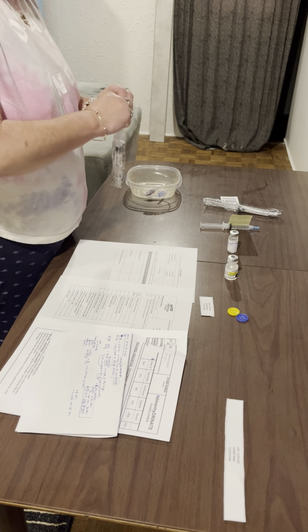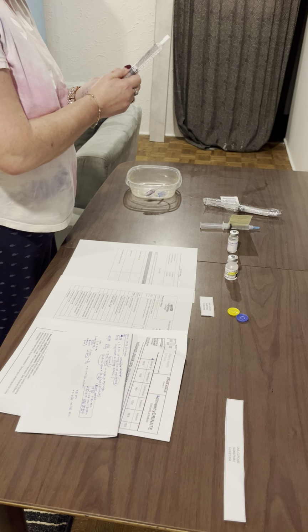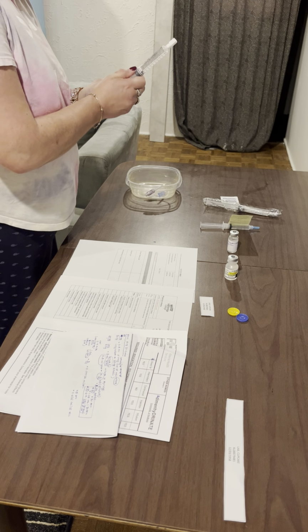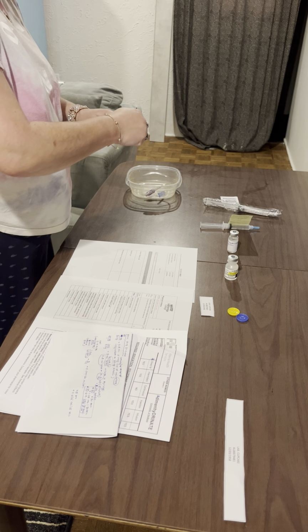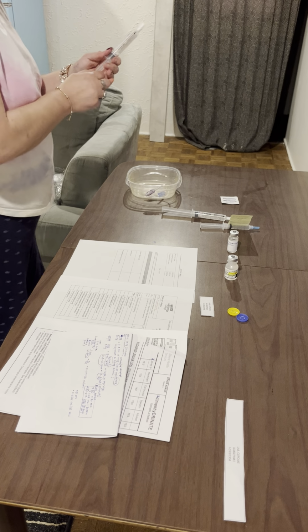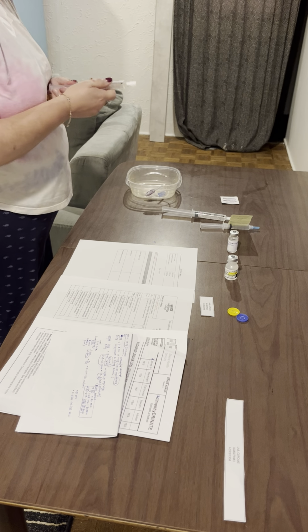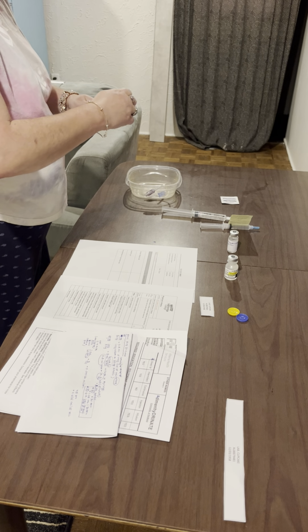So we're just going to open those. And again, maintaining sterility. So we're just going to pull the plunger back a little bit and just break the seal by pulling it a little bit. Great. We'll take the cap off. And we'll open the second one. Okay, and again, we'll pull back and we'll pull a little forward just to break the seal. Okay, so we'll take the caps off of those.